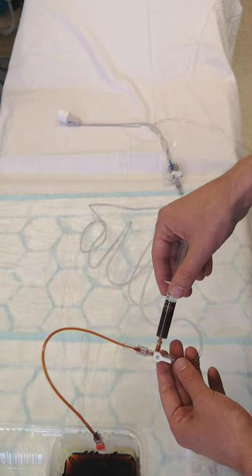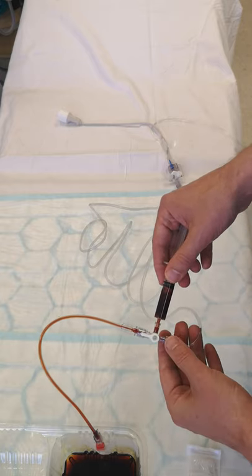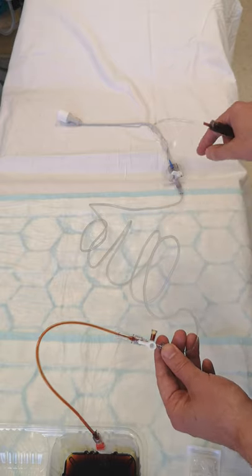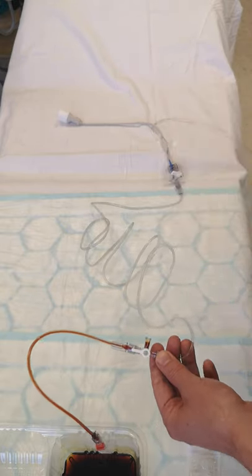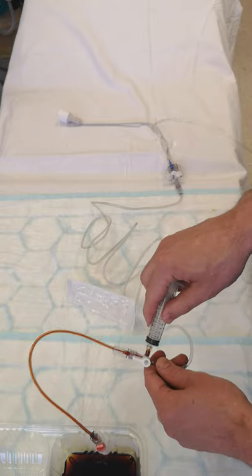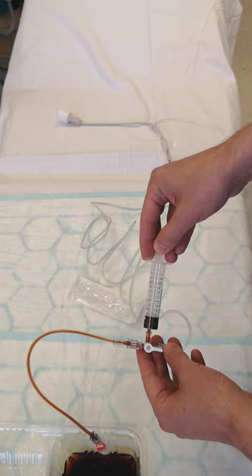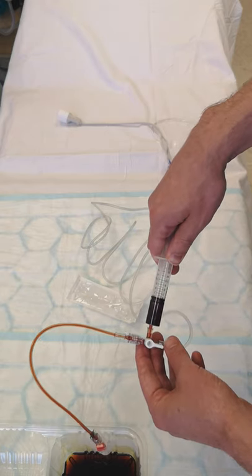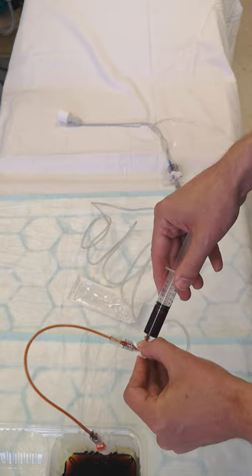You need to ensure the blood isn't diluted by any saline, otherwise you'll get an erroneous reading. Then turn the stopcock 180 degrees so it's off to the patient, and you can safely remove that syringe — no blood will leak back. That syringe gets discarded. Then put the second syringe on, open to the patient again, and aspirate your actual blood sample for blood gas, lab samples, point-of-care, ROTEM, TEG, or whatever.